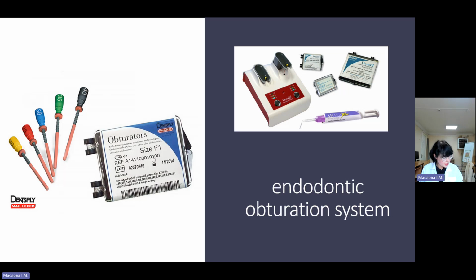And the next part of our lecture will be the description of the gutta-percha points and its advantages. Gutta-percha has many advantages: being inert, dimensionally stable after treatment, non-allergic, antibacterial, non-staining to dentine, radiopaque, compactable, softenable by heat, soluble by organic solvents, and easily removable from the canal when necessary.